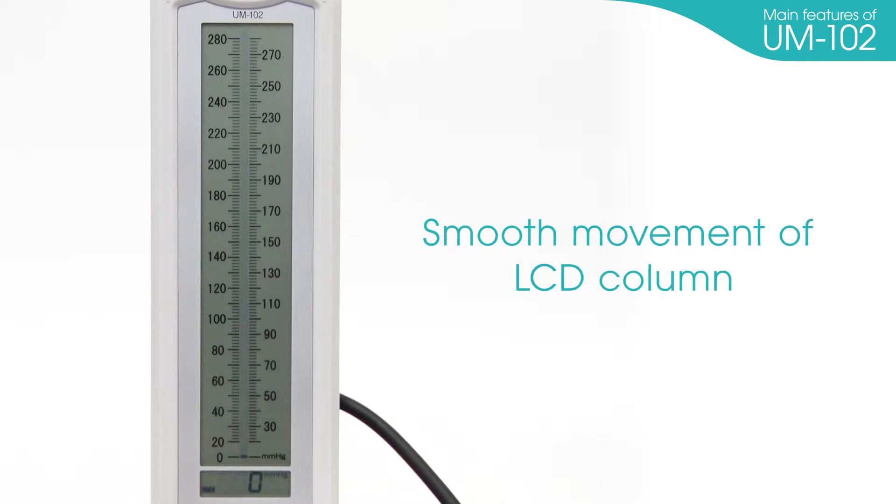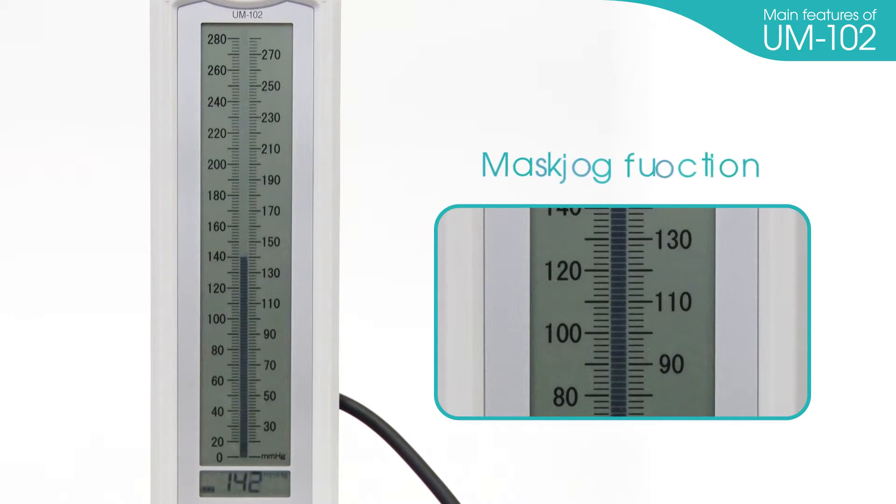Smooth movement of the LCD column. The LCD column moves smoothly like a mercury column and ensures accurate measurement. Marking function: you can mark specific values like systolic and diastolic blood pressure — you no longer have to memorize or write down the data.